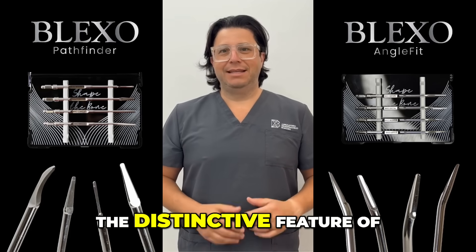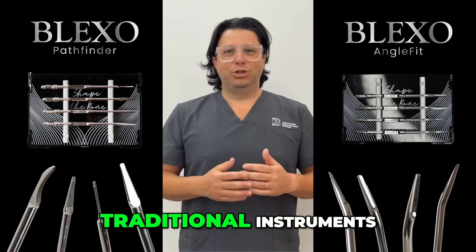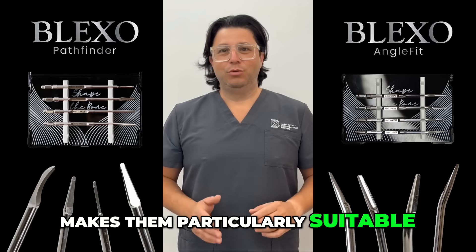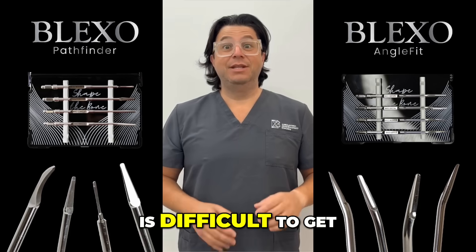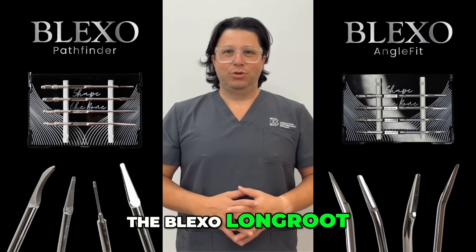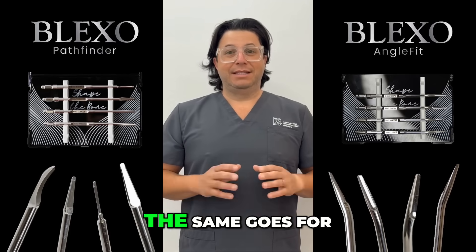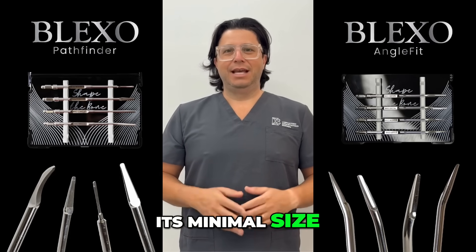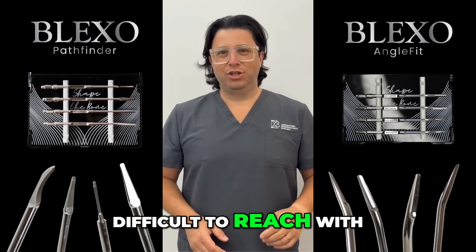The distinctive feature of all these Blexo instruments is that they have minimal thickness compared to traditional instruments. The reduced size also makes them particularly suitable for use in situations where there are fractured roots in which it is difficult to get a grip for extraction. The Blexo Long Root extractor is ideal for retrieving apices or fractured roots, and similarly the Micro instrument, precisely because of its minimal size, is able to luxate those apices that are difficult to reach with other instruments.